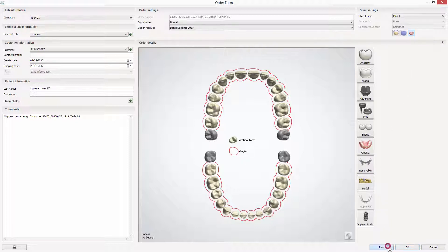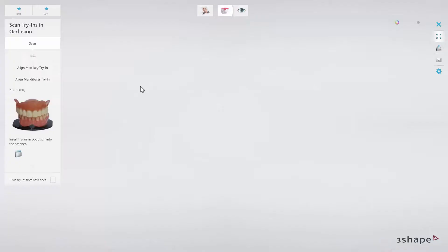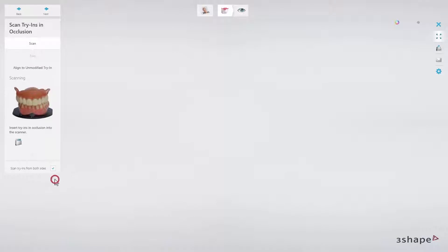Now press scan to get to 3Shape Dental, having scan try-ins in occlusion as the first step. Make sure that the scan try-ins from both sides option is chosen to enable the full scanning scenario. Otherwise the system will capture vestibular side modifications only.